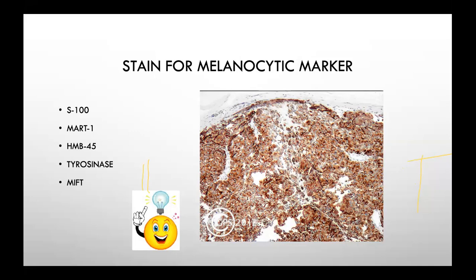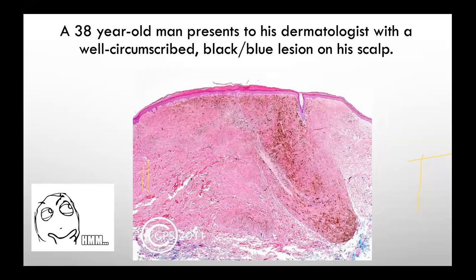But as you know, S100 is not specific for melanoma, so it can be present in other lesions as well. So don't depend only on S100 if you have a couple of differential diagnoses in your mind. Okay, so let's move on to the next case.